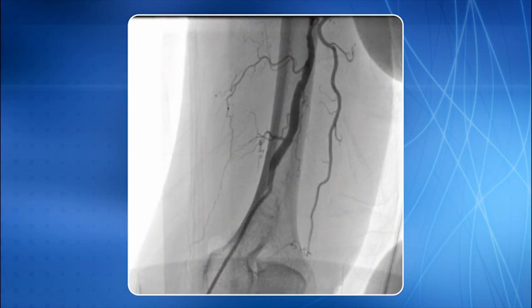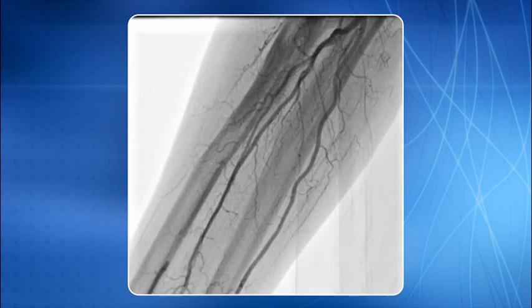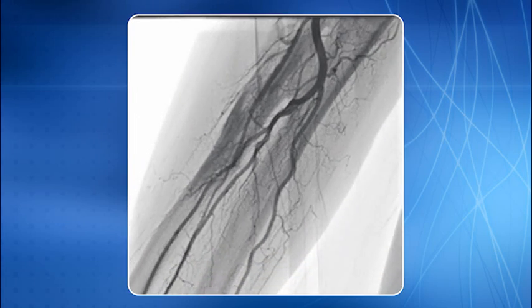Understanding of different loops occurring in the radiobrachial region is very important. It gives you confidence to deal with them effectively. The loops can be broadly classified as simple loop, more challenging loop, and most challenging loop. We will discuss this issue one by one, stating relevant examples.